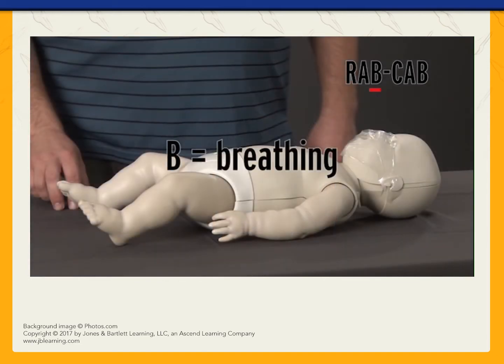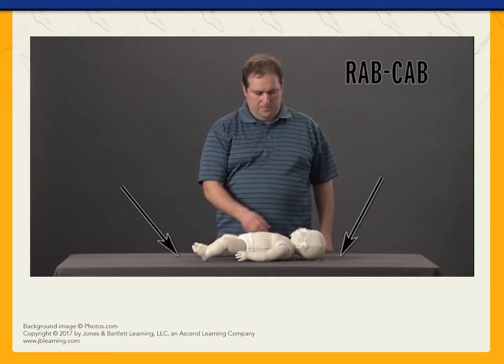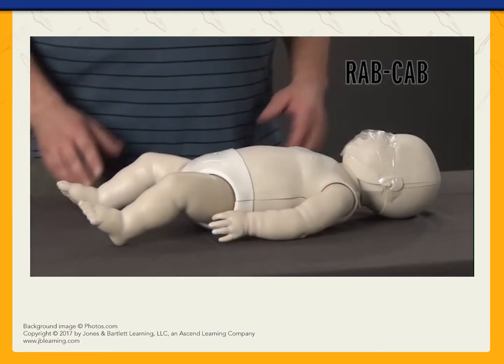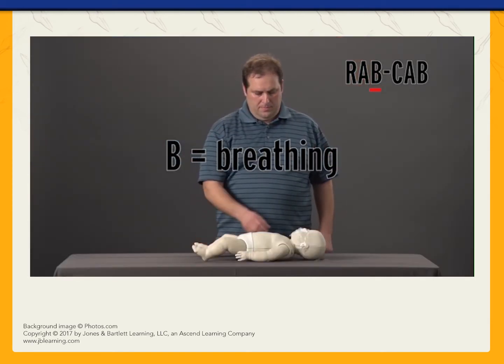B stands for breathing. Position the infant face up on a flat, firm surface. If possible, use an elevated surface such as a table or cabinet top. Take 5 seconds, but no more than 10, to check for no breathing or only gasping.